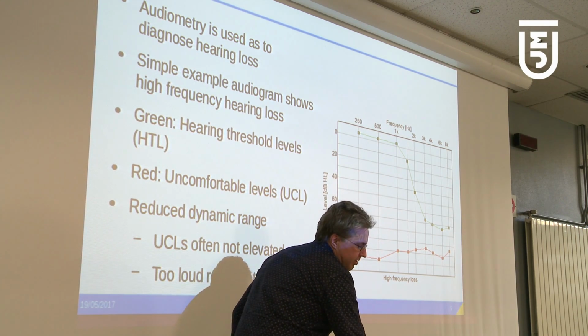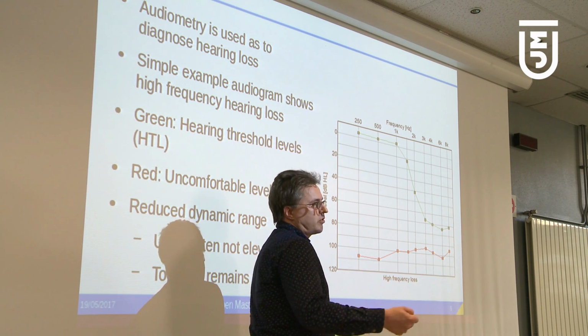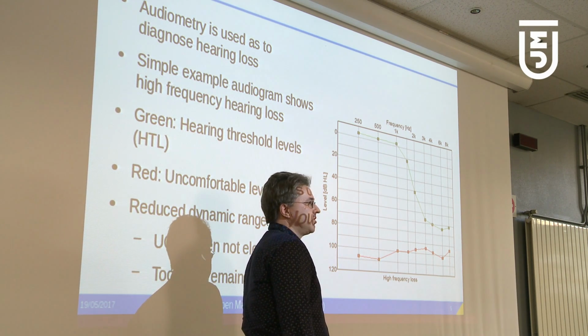The red points are the uncomfortable level. You can also measure, well, draw or turn the sinusoid so loud and ask the person, okay, raise your hand when it's uncomfortably loud.